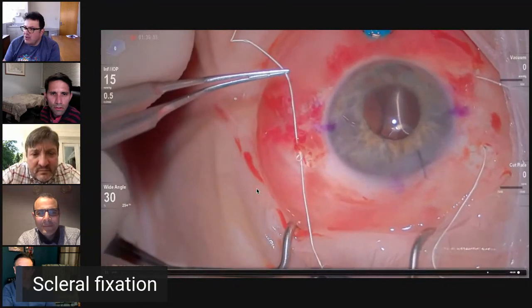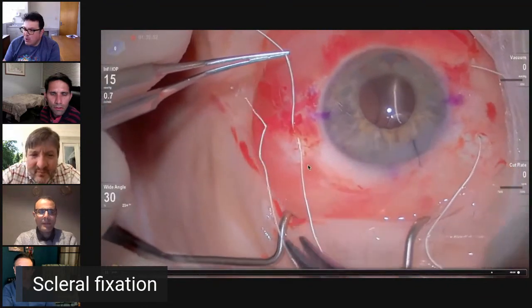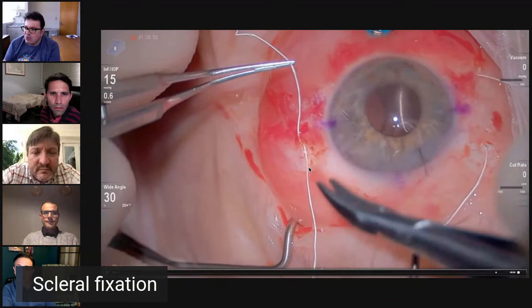So you have a very small opening that you can close with one or two sutures, or I glue it. But it's very nice, because these patients used to come with a very, very red eye and lots of irritation from the Vicryl. So I really like it this way.